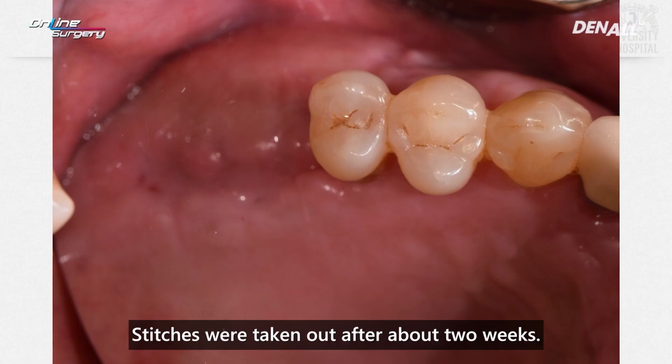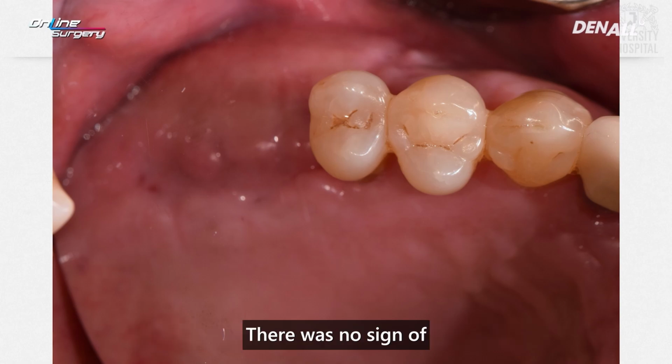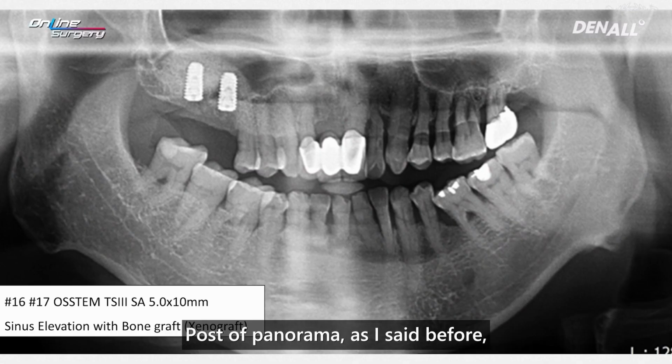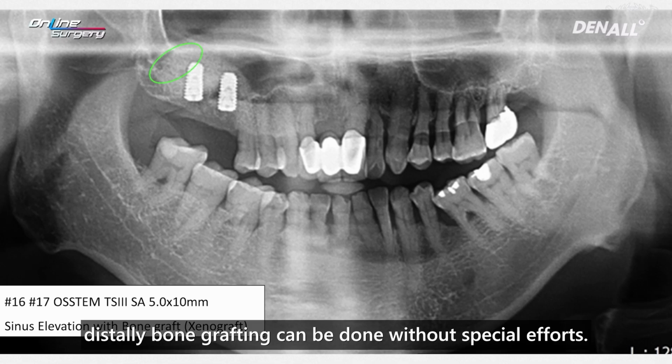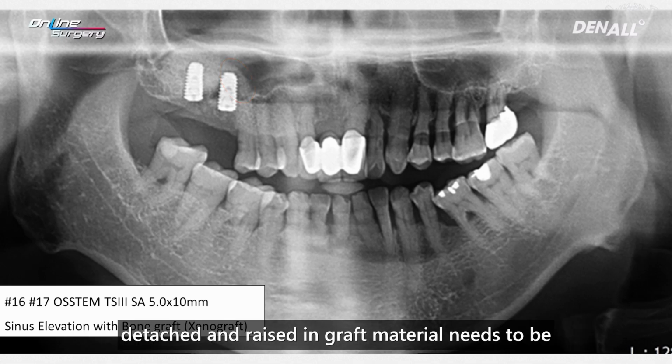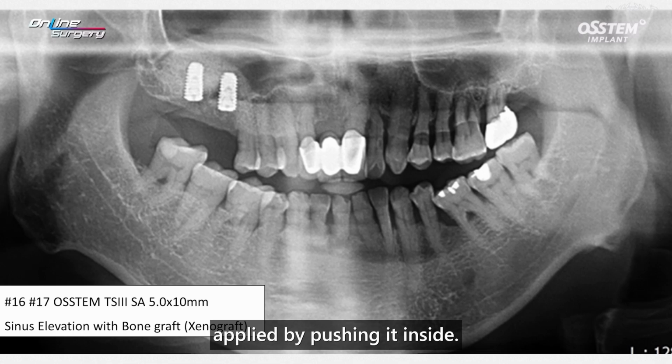Stitches were taken out after about 2 weeks. There was no sign of infection and the gum is very well healed. Post-op panorama. As I said before, distally bone grafting can be done without special efforts. Therefore, graft material should be put to the mesial side. The membrane should be detached and raised, and graft material needs to be applied by pushing it inside.